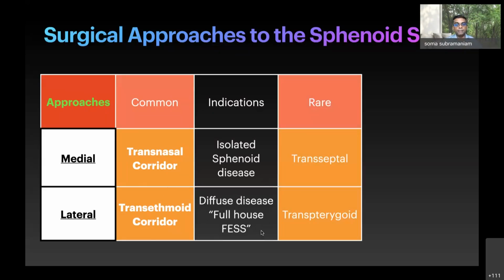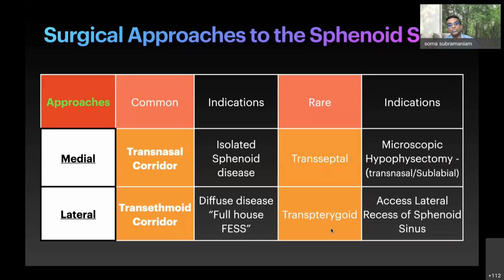And a less common medial approach that we use is actually the transseptal approach. And the less common lateral approach would be the transpterygoid approach. The transseptal approach today is hardly used. It's mostly for historical purposes. It's usually used by neurosurgeons who are trained in the transseptal approach for sellar and pituitary surgery. This is rarely used today, but it's still an option.